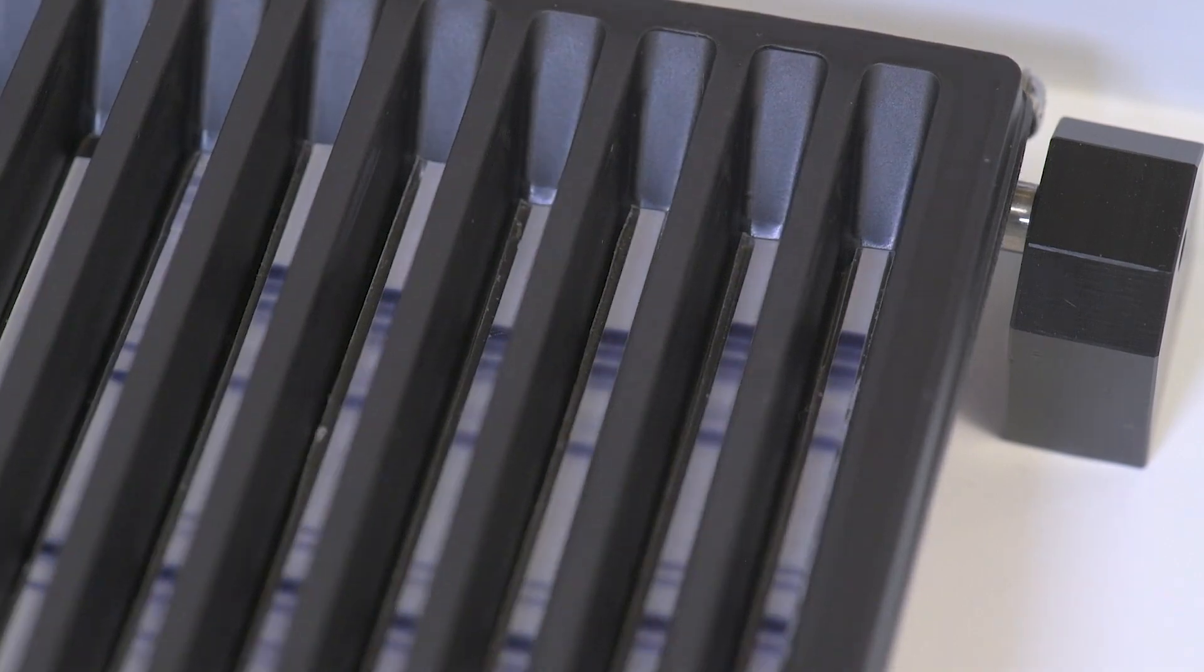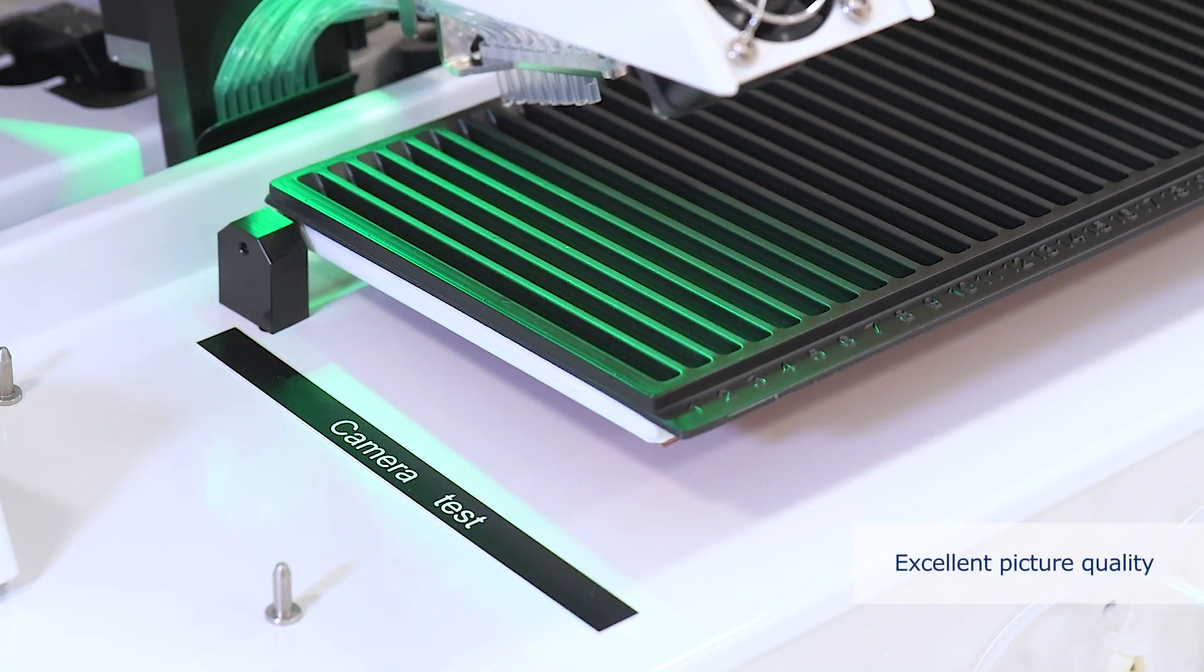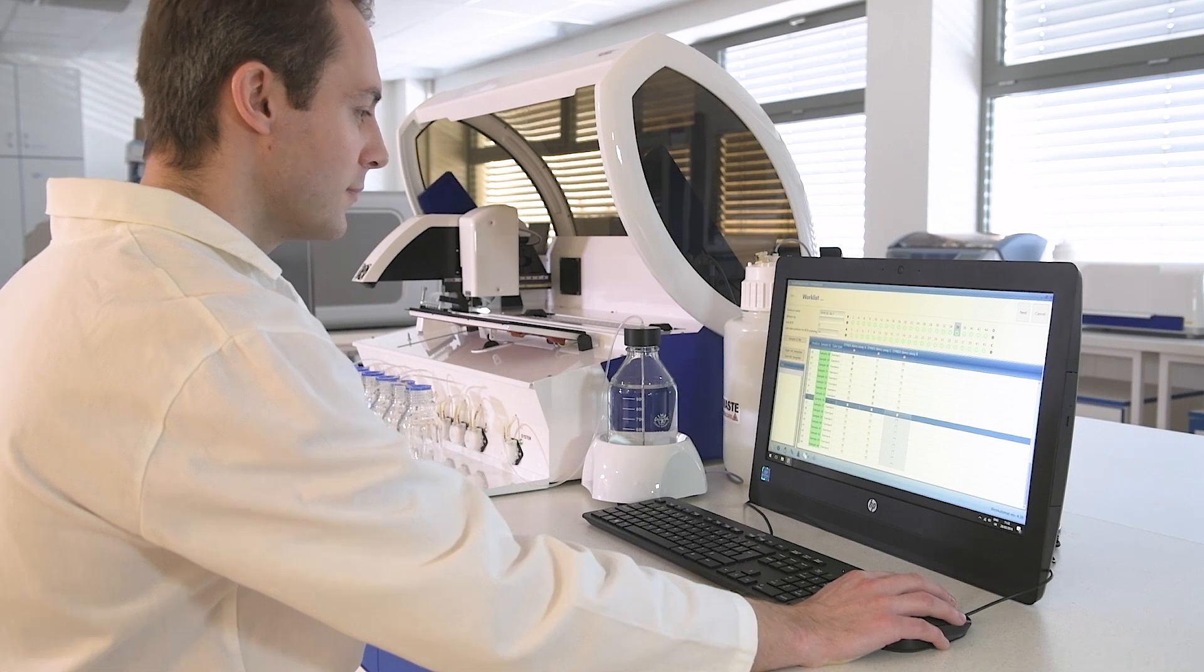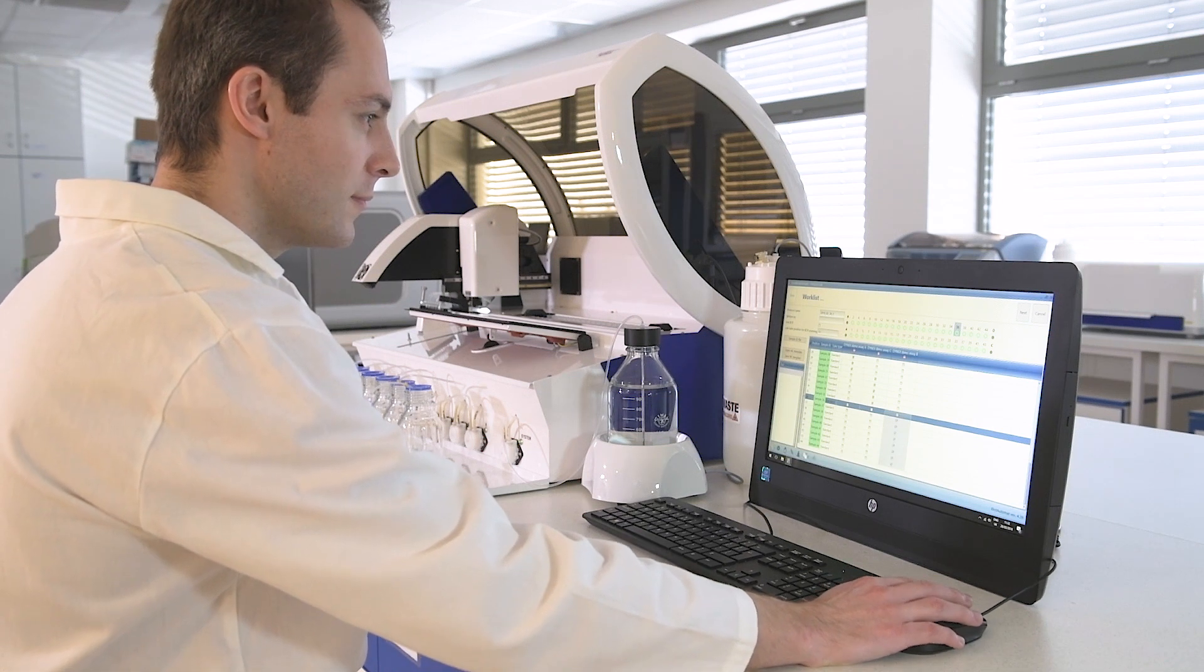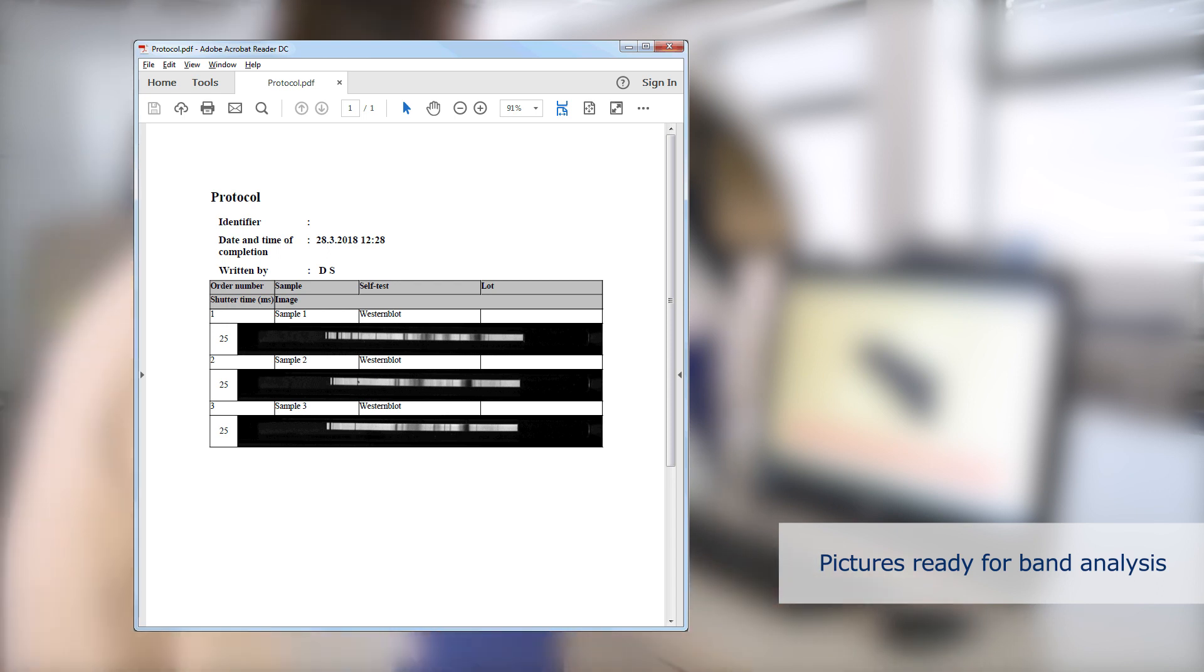The integrated CCD camera is optimized for reading the strips. We've refined the optics to provide a sharp and high quality output and to prevent reflections. This results in a remarkably pure picture ready for easy band analysis. The pictures are then exported to an evaluation software.